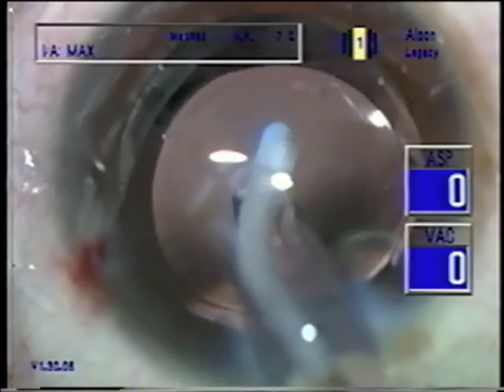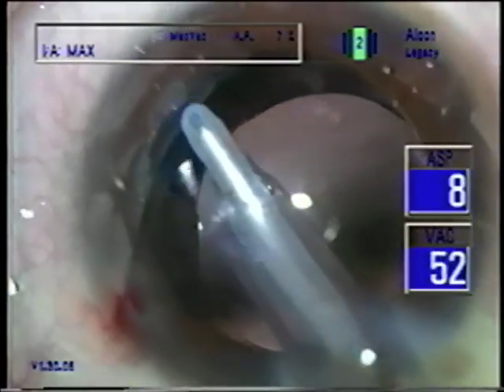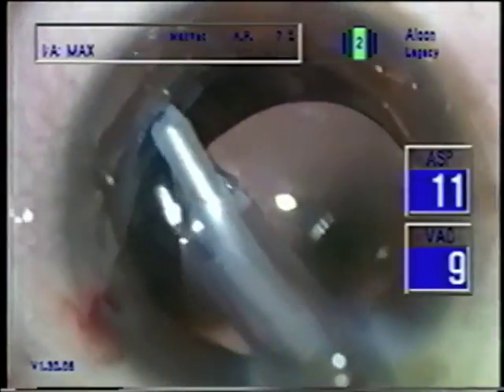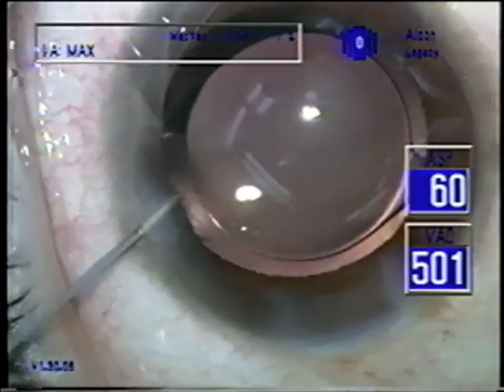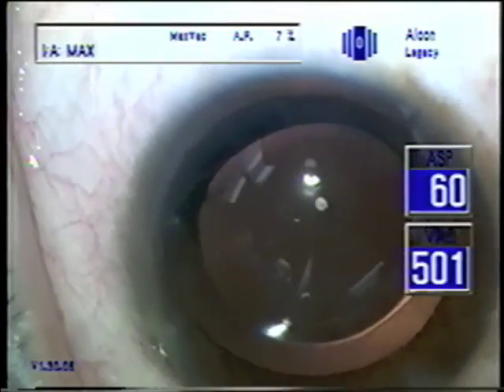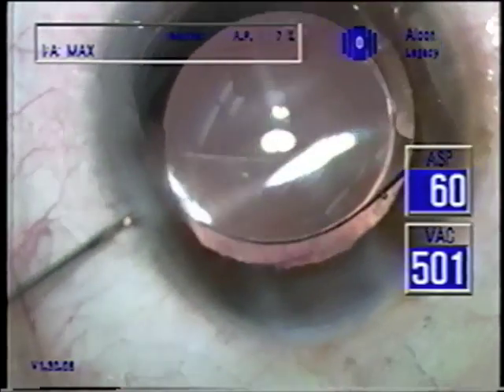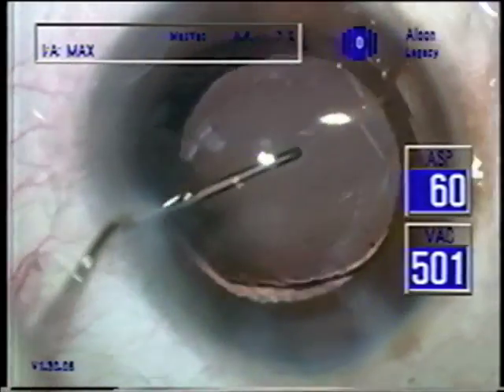Notice there's reverse pupillary block if I just break the adhesion between the iris and the capsule. There was just a little strand of cortex I was going for there. If you break the adhesion between the capsule and the iris and the chamber shallows, patients will feel that stretch of the iris root. So that's just balanced salt now to re-inflate the chamber, and then I'm putting the vancomycin under the lens.